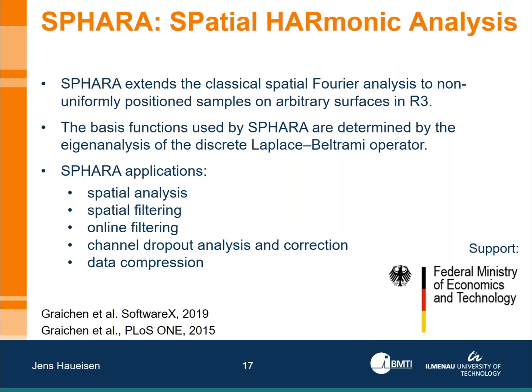The basic idea is quite simple. We do what you know from a standard Fourier analysis in the spatial domain, in the EEG sensor domain, basically. The difficulty is that our EEG sensors are not like the typical image grid, so they're not regular. And in order to handle that, we do an eigenanalysis of the discrete Laplace-Beltrami operator.